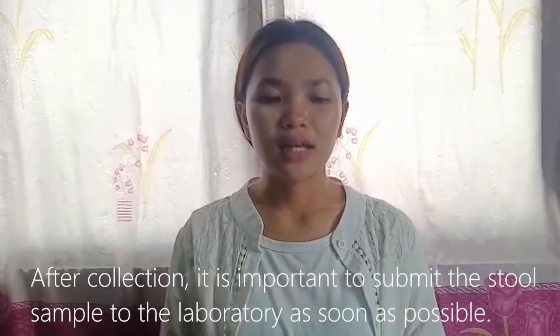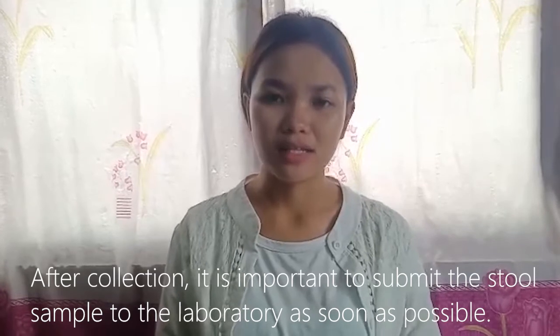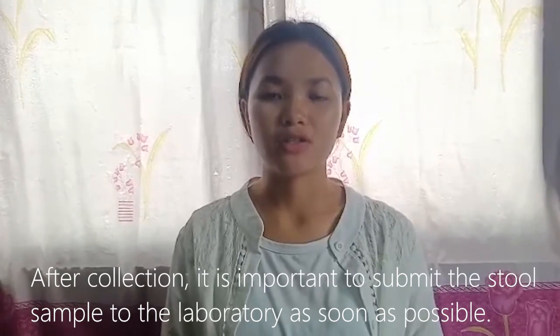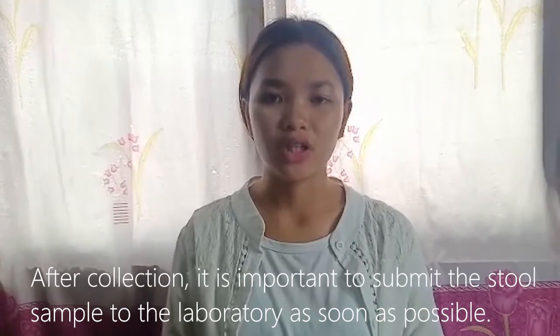So after collection, it is important to submit the stool sample to the laboratory as soon as possible. This urgency is because some parasites, especially those found in watery stool samples, may be difficult to find after 30 minutes have passed.